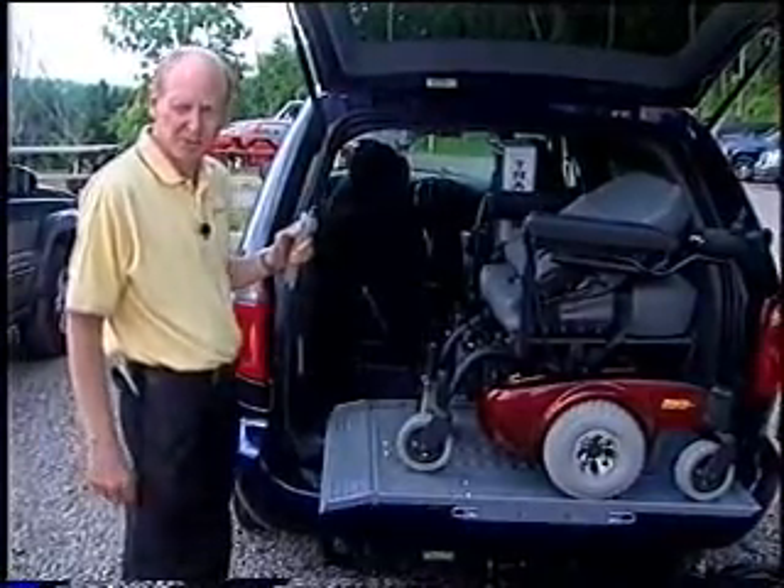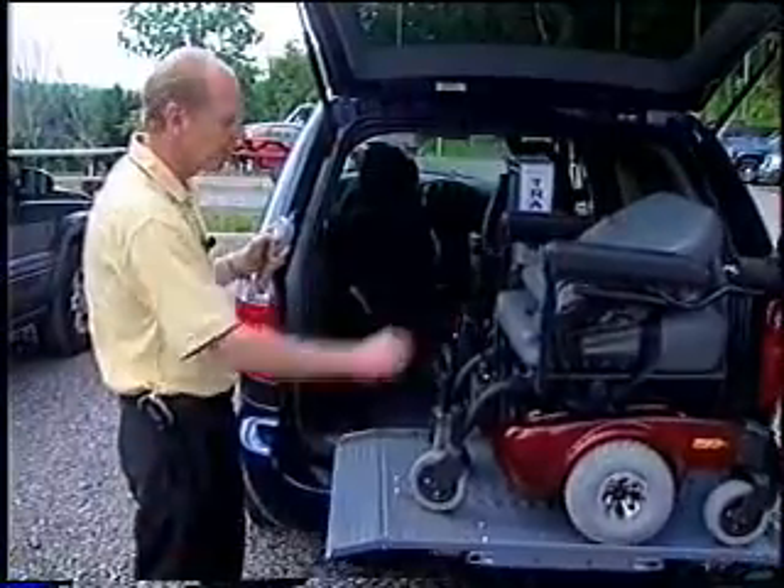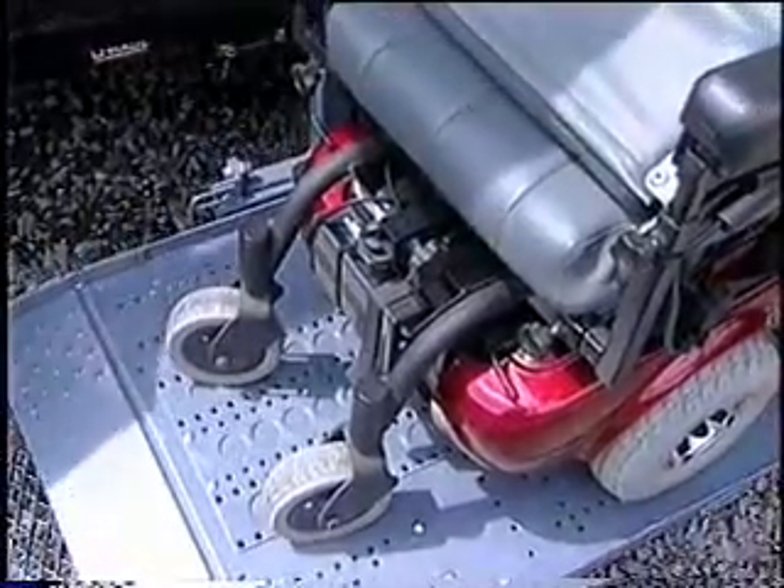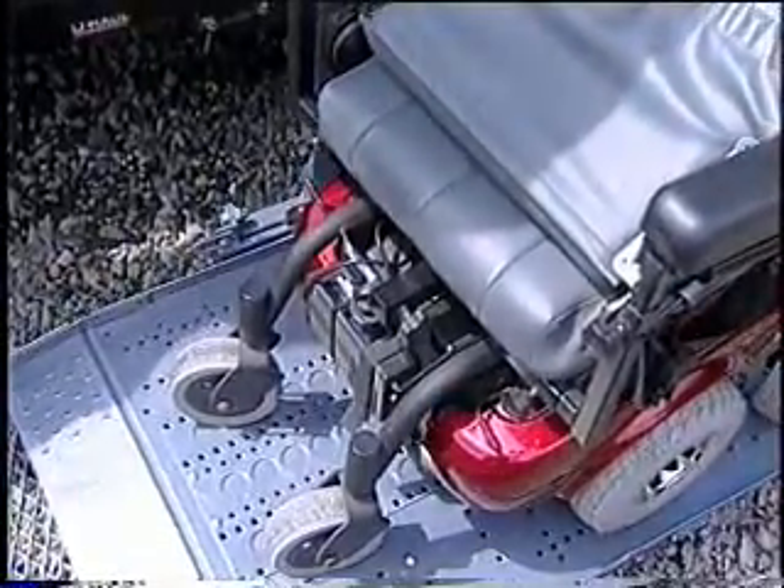This lift can fit most power chairs, medium or large, and almost all scooters on the market. Freedom has a bracket to go around the fold-and-go seat-in system, so there's no drilling in the vehicle.